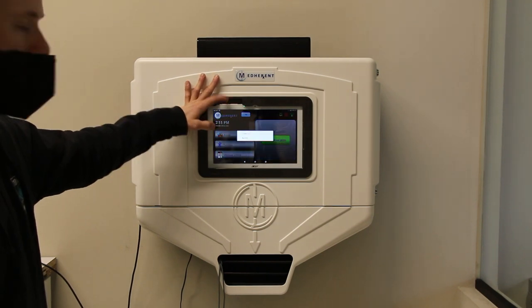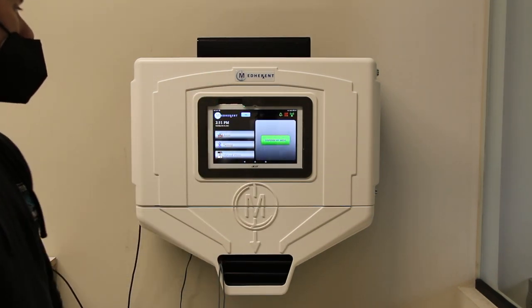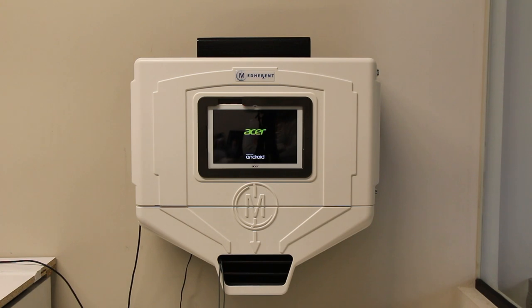To restart the device, hold the power button down and tap Restart on the pop-up message. The screen of the device will cycle through some of the same startup screens before automatically returning to the MedHerent home screen.